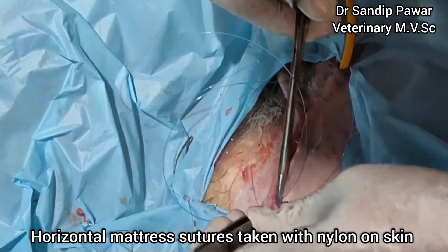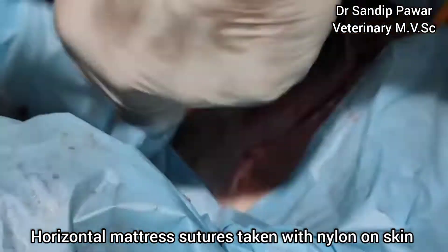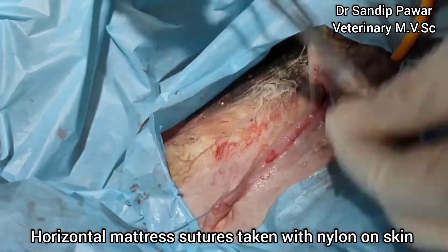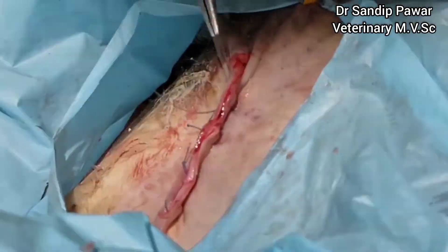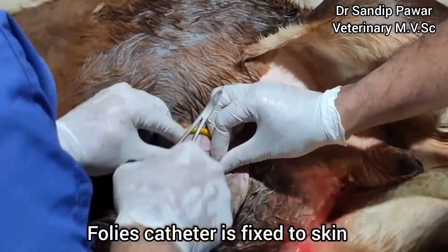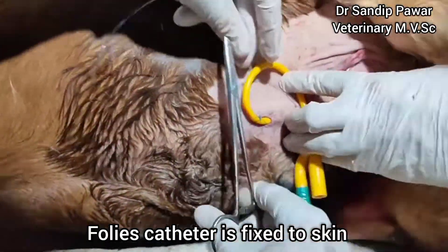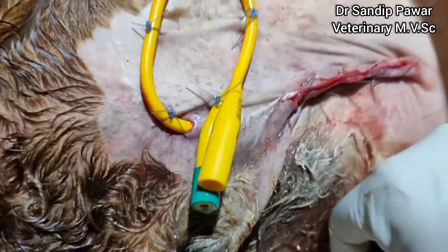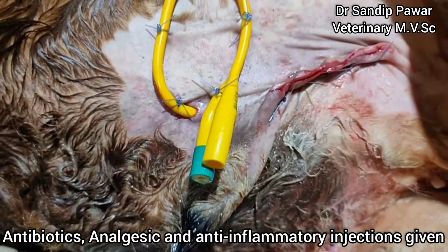After that, the Foley's catheter is fixed to the skin using stitches. This is how the tube cystotomy was performed. After the surgery, antibiotic, analgesics, and anti-inflammatory injections were given to the calf.